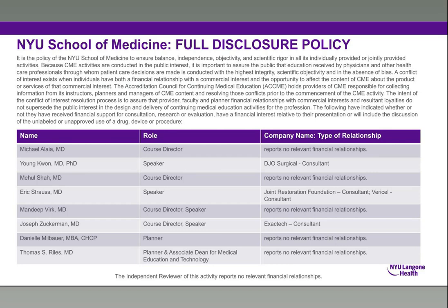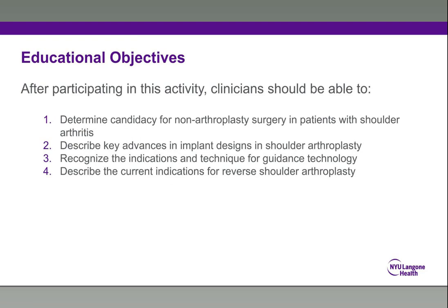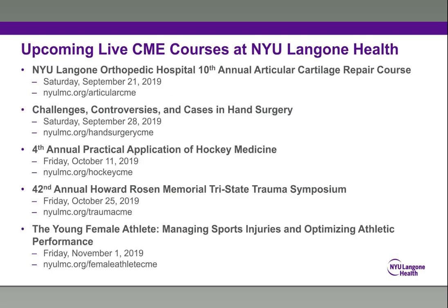So I only use stemless in younger patients with good bone quality, and I would not use it in somebody over the age of 50, as an arbitrary age. I don't see very many of those patients, but those are the ones I would use. I think your idea about testing the quality of the bone by pressure is a good one. But I also think that, compared to others, I probably underutilize stemless because I think the stemmed or short stem implants have worked very well.